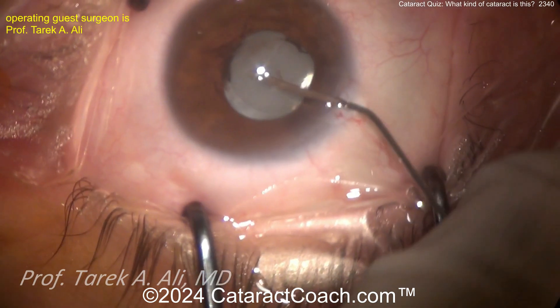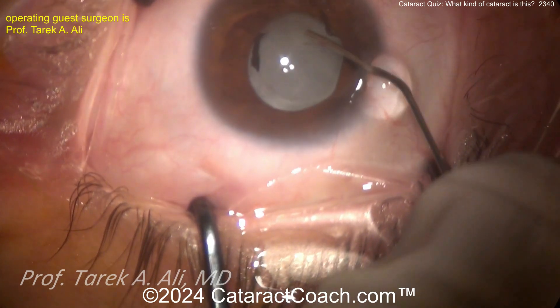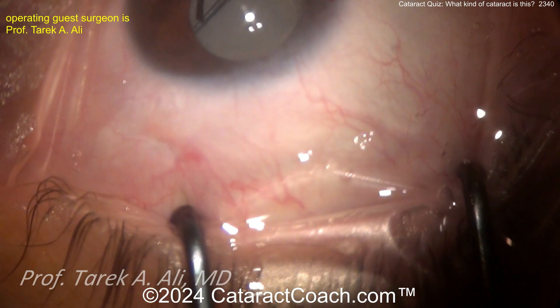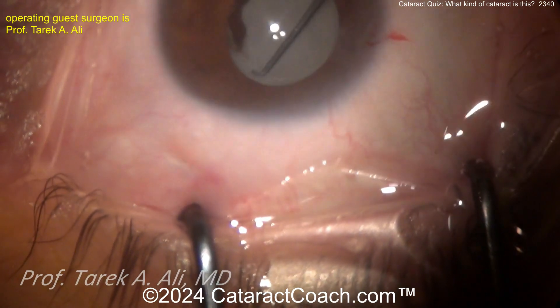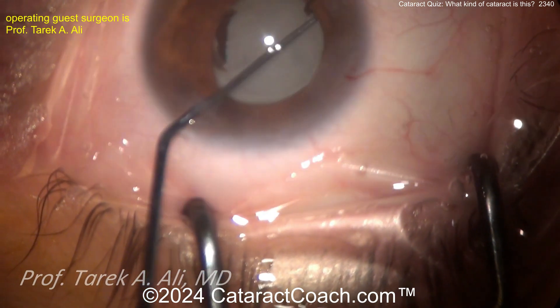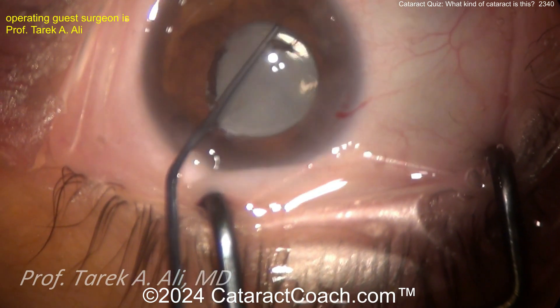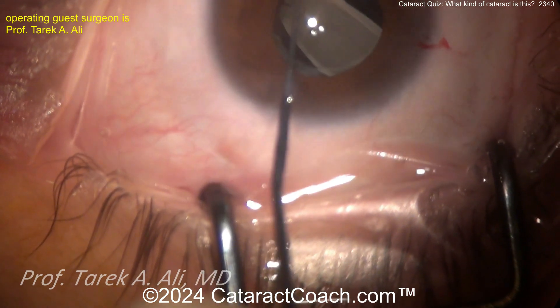It's not clear if the patient already had a YAG laser capsulotomy — can't really tell since that lens is pretty opaque. More viscodissection is always a good thing. Getting under the rhexis edge with that Sinski hook looks good — that's a reasonable approach. Getting under it and going in the other direction, nice and easy, going across and lifting it up.